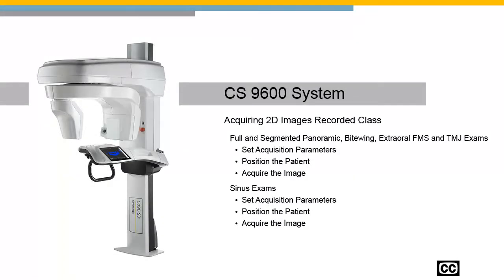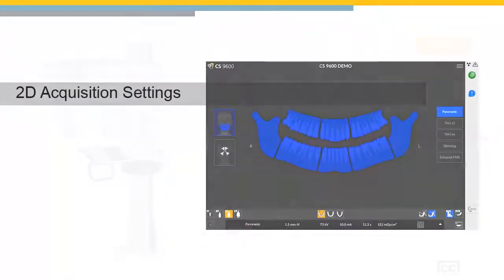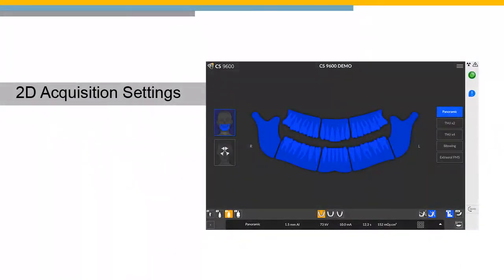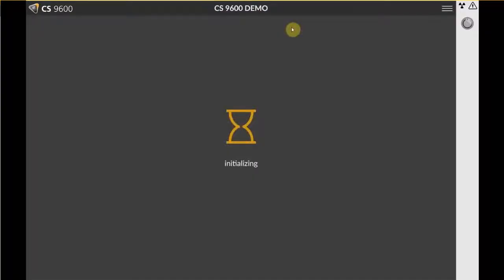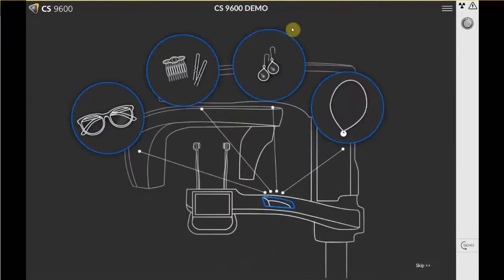CS9600 System, Acquiring 2D Images Recorded Class. To set the acquisition parameters for Full and Segmented Panoramic, ByteWing, Extraoral FMS, and TMJ Exams, follow these steps. Launch the Panoramic Acquisition Interface from the acquisition computer.